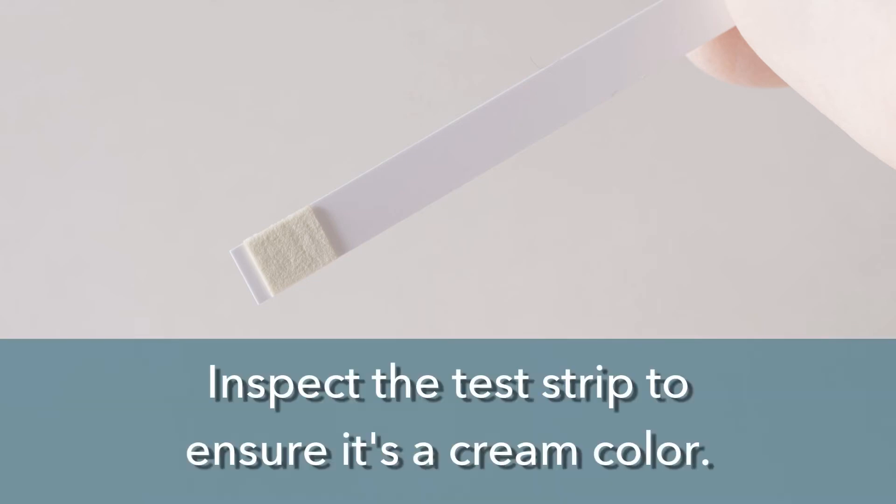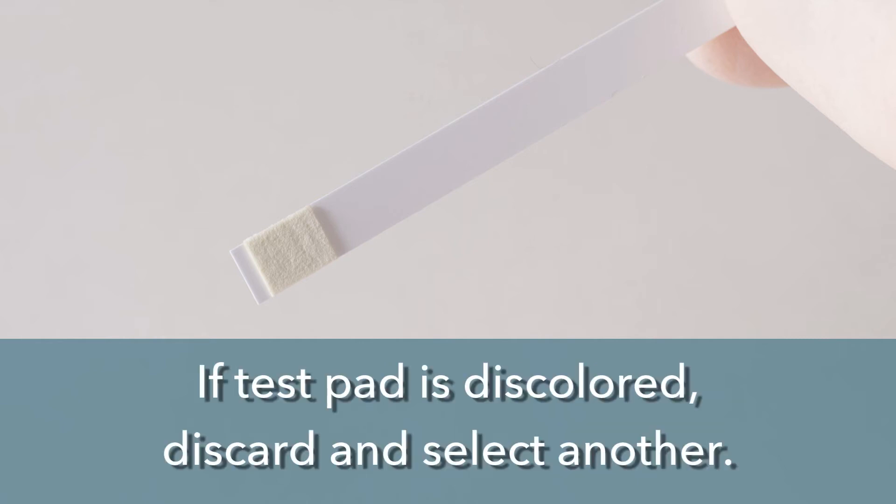Next, open the package in the presence of the donor and inspect the test strip to ensure the test pad is a light cream color. If the test pad is tan or discolored, discard the test and select another test kit.